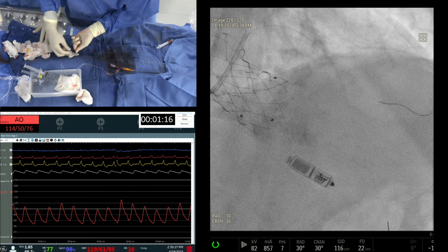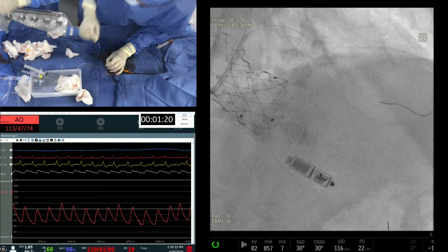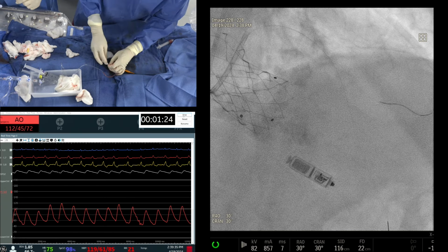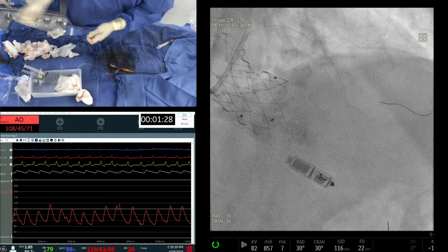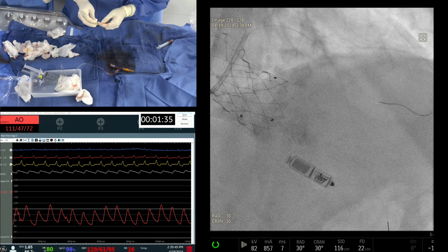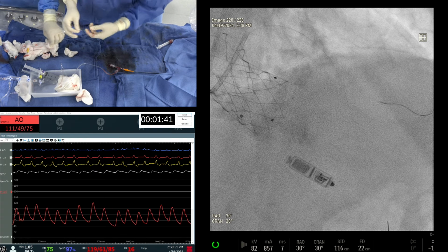Give me IVUS quickly. I just want IVUS to see what IVL did to the side branch, and then it's so simple: we just balloon it and stent across. So we can put a 3.0 and then post-dilate the proximal, right? Is that what you want? You want a 48? Yeah, 3.0 by 48. What's the IVUS length?